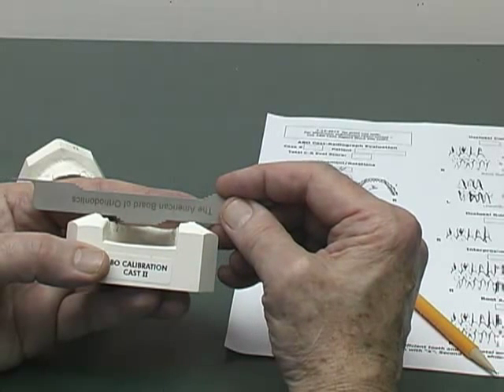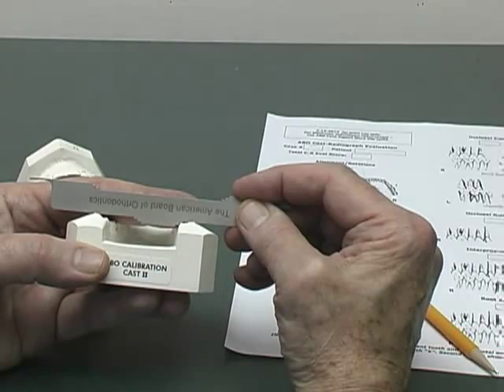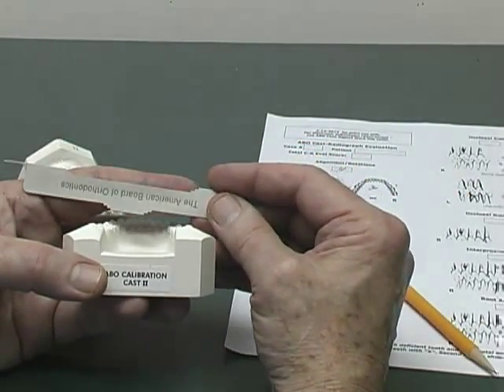We move to the right side, and it looks like it's between 1 and 2, so it would be 1 point. So 2 and 1 for the lower second molars.